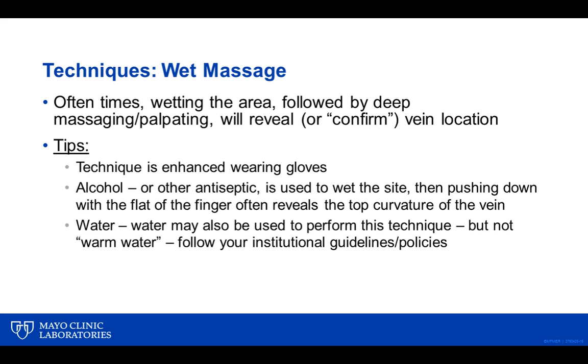You can certainly use water, warm water. I'd be careful with that, but again, follow your institutional guidelines and policies, because oftentimes what's warm to us may not necessarily be warm to the patient. In fact, it may be a little too warm. So use that wet massage as more of a confirmation of what I feel is really there.